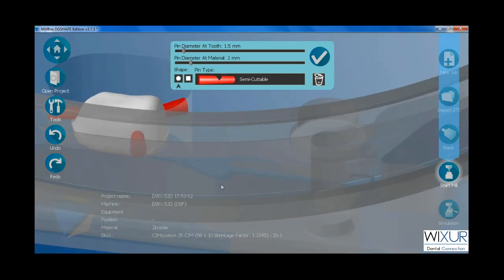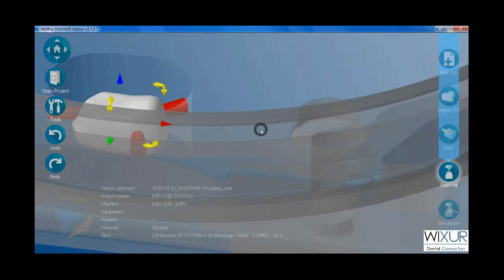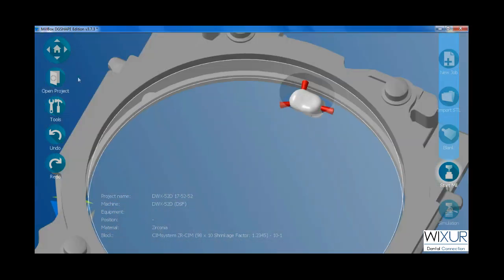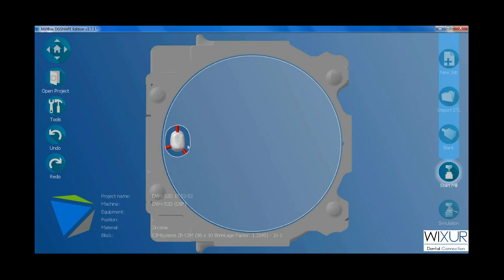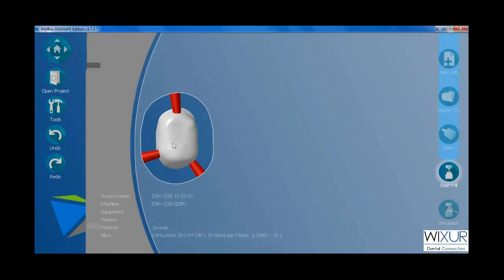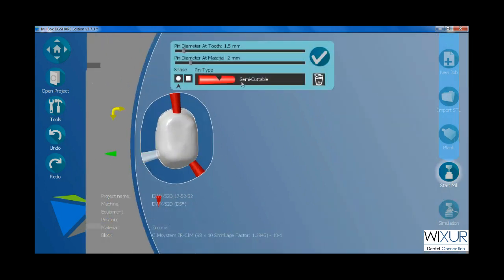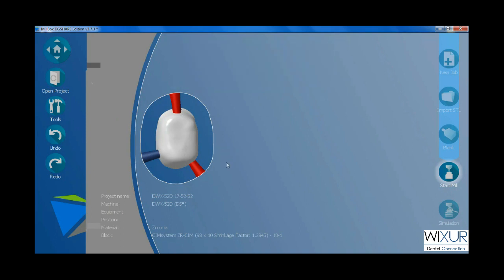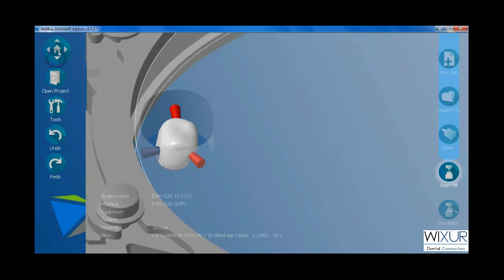When done, click on check mark. If you decide to change the type of pins, simply click on it. Use first option on the left side to change the views.